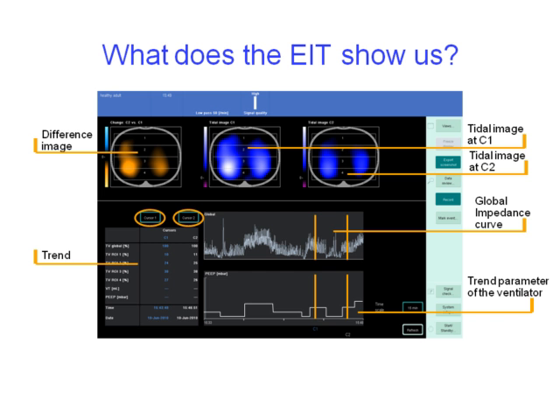So when you look at the new device, you see two electroimpedance tomograms before and after a maneuver, and you can also look at the difference between the two images, telling you if you have an increase or a decrease in ventilation and in what areas.